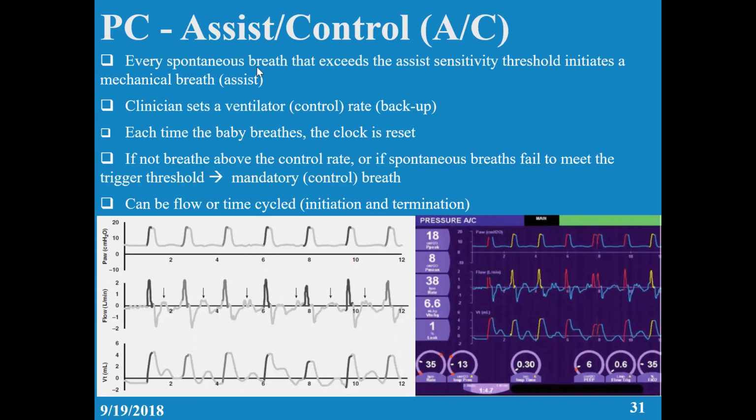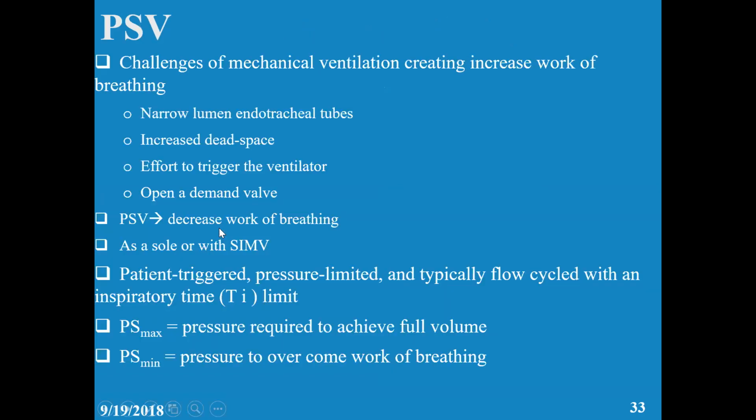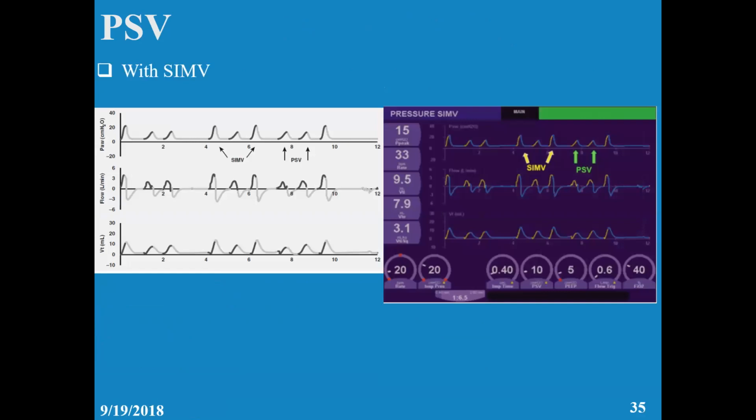Okay, I'll finish soon because we only talked about graphics today. Usually I give graphics and loops at the same time. But when we take clinical, you will learn more. So again, this is assisted control because you can see PSV. This is a graph of PSV. It's a flow cycle. This is a combination of PSV and SIMV. I will teach you that later.